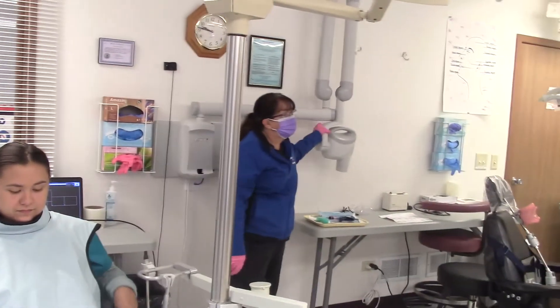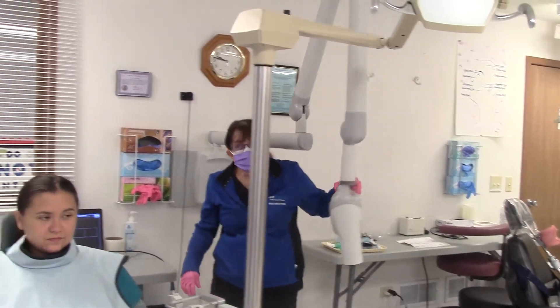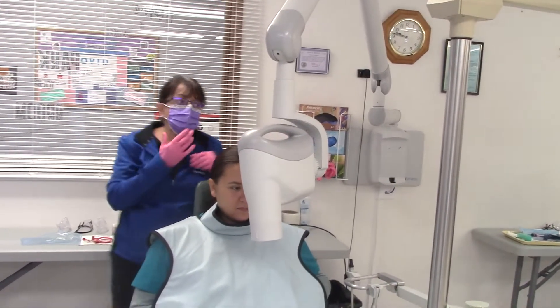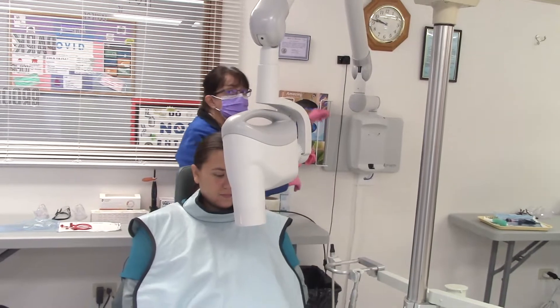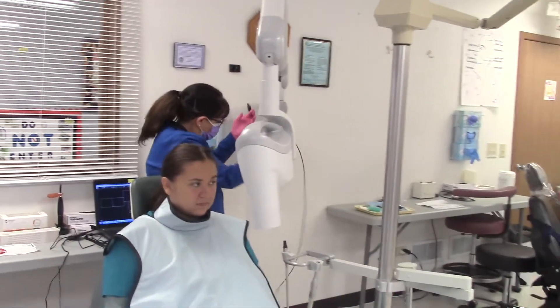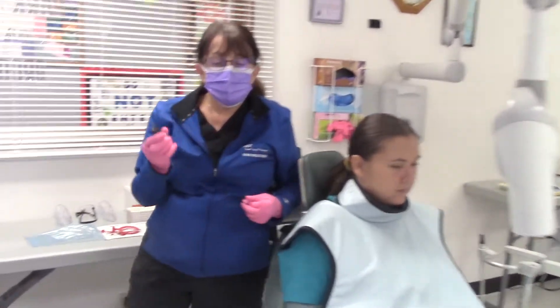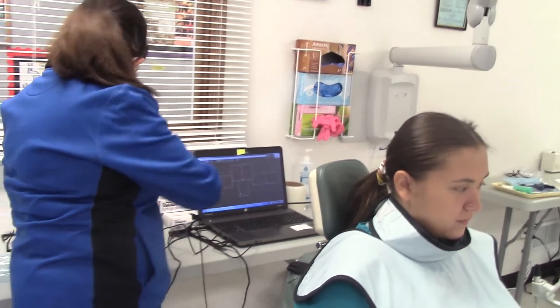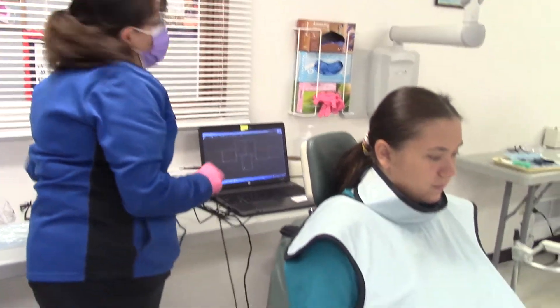Next, we're going to turn on our x-ray unit and bring the head of the x-ray with us. We're going to be taking bite-wing x-rays on our patient. This is our sensor, and we use this with a computer program.